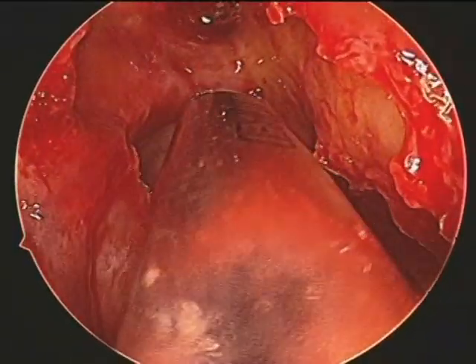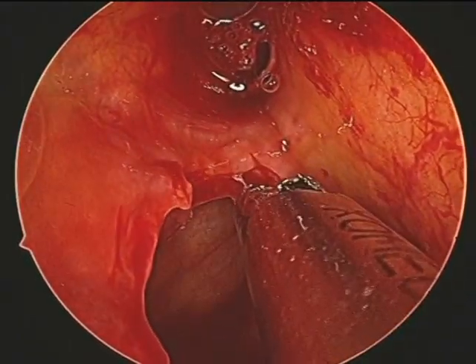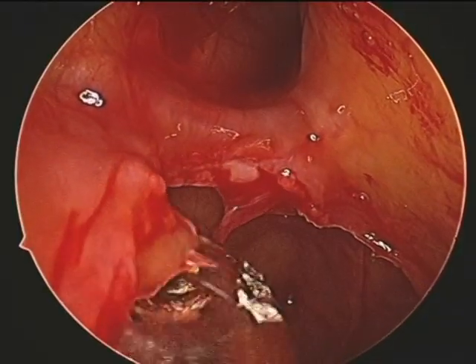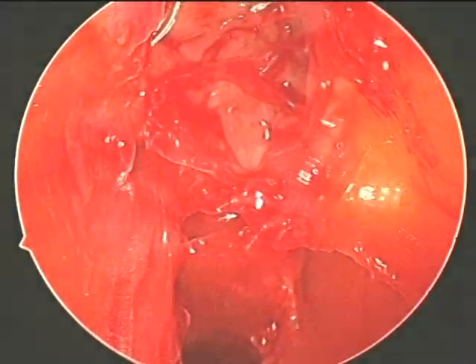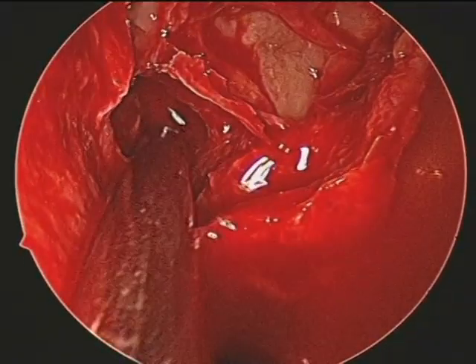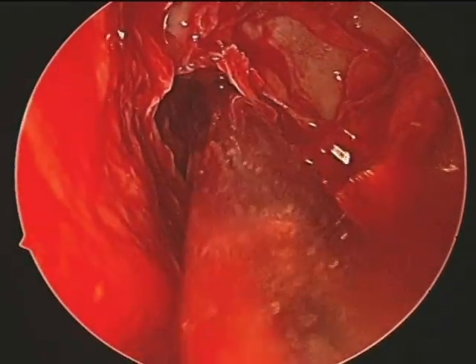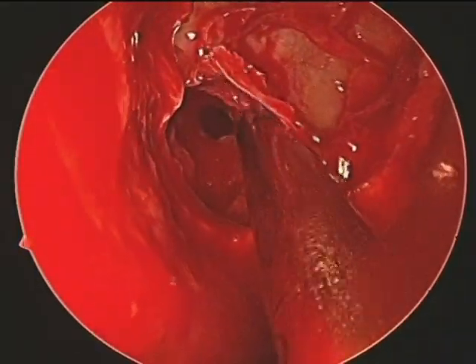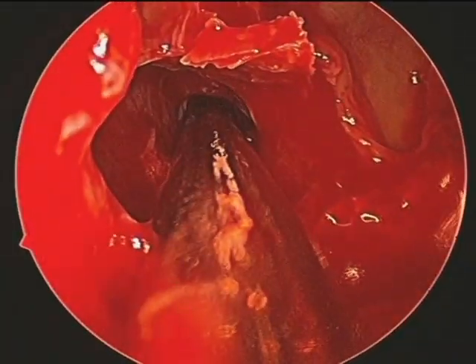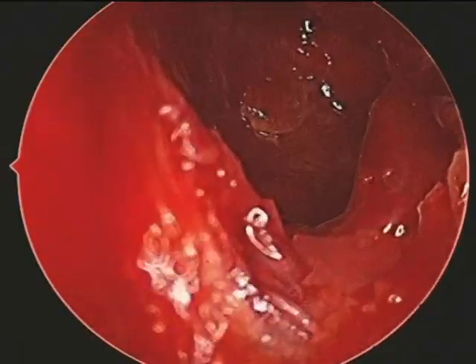You need to exercise a lot of caution here. That is the anterior ethmoid artery — you can see it clearly. Now this is the posterior ethmoid and that is the sphenoid os. We take down the posterior partition so as to gain access into the left sphenoid os, widening the sphenoid os by completely debriding the posterior ring. That is a clear view into the left sphenoid sinus.